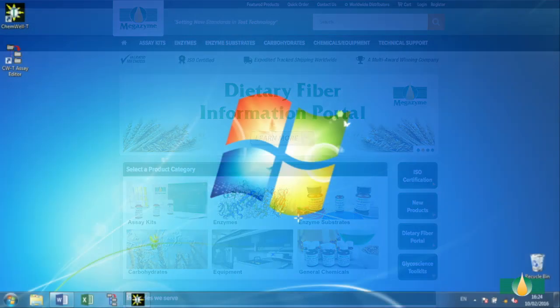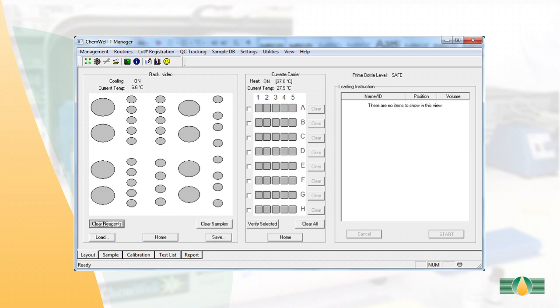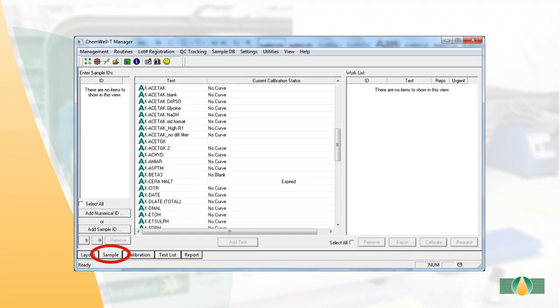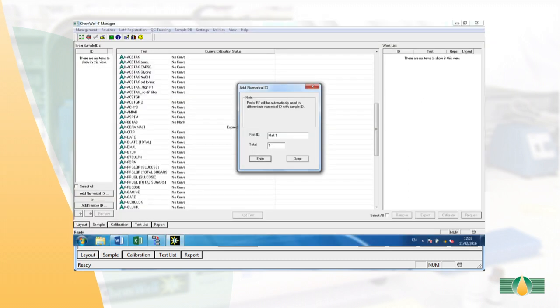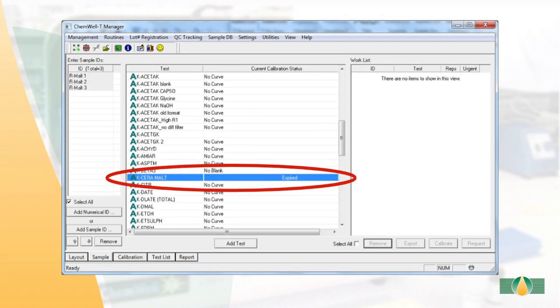To run the automated assay, open the ChemWell Manager software and select the sample tab. Select add numerical ID and input IDs for all samples. Highlight all samples to be tested and select the appropriate pre-loaded test file from the test list, then select add test.